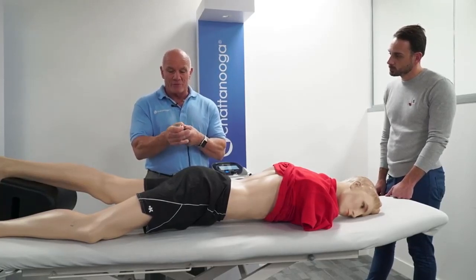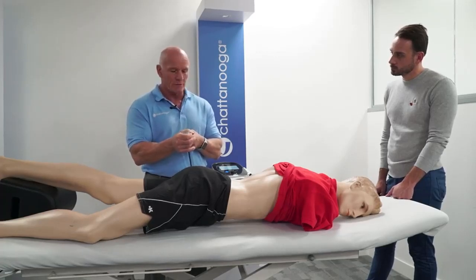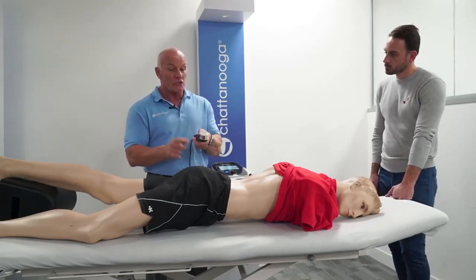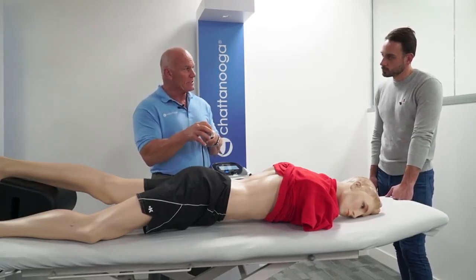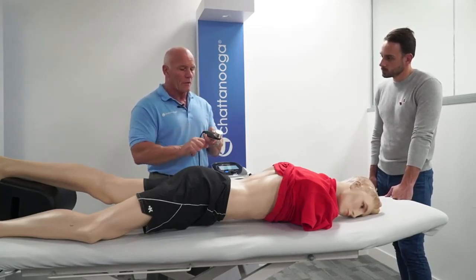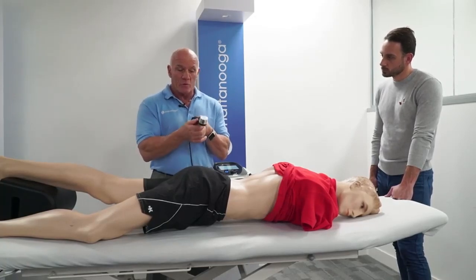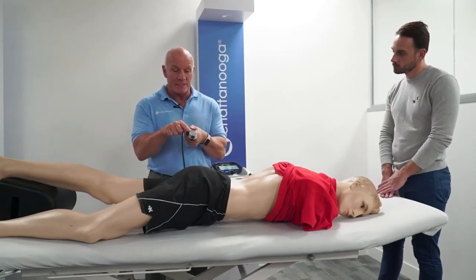But there is nothing to stop a manufacturer putting a 1 centimetre crystal in a 10 centimetre head. Are you with me? Okay. So just because you see that size doesn't mean to say that is the size crystal. So these are the type of questions you need to ask your salespeople. What is the BNR of your crystal? What is the ERA of your crystal? Okay, because you want the whole crystal. If I want to, and we're going to use this on our patient later, this 10 centimetre head, I want that 10 centimetre area covered on my patient.